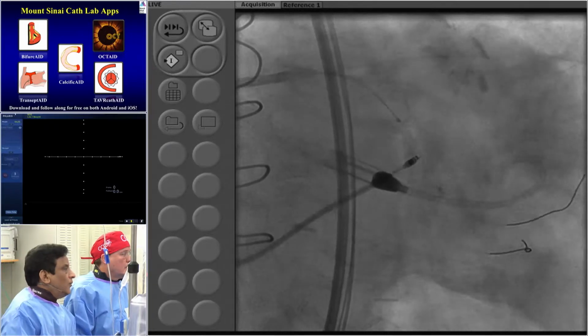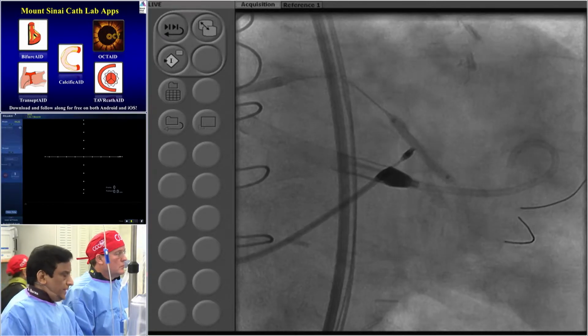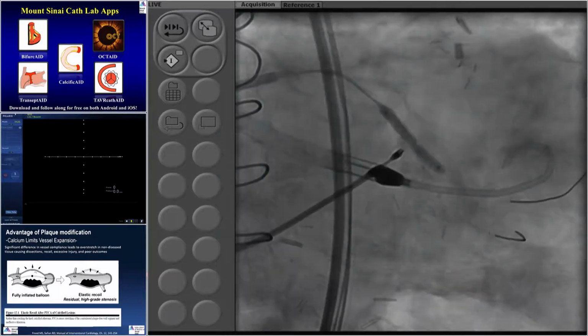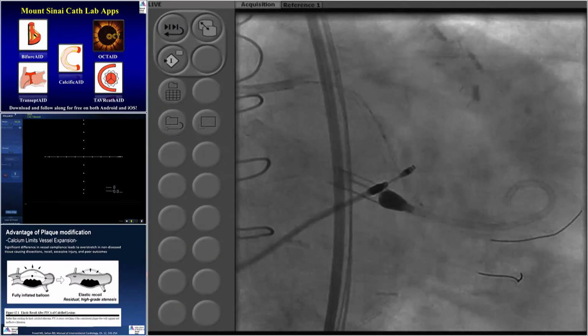So the key is we are opening that branch. Same provisional stent. We try not to do a second because both the branches were diseased. So the same 2.5 balloon, 20, we are using here. Okay, I'll finish here. I'll put 2 stents. Yeah, so we'll do it now. Let's get the stent ready. So we are using a Synergy stent.